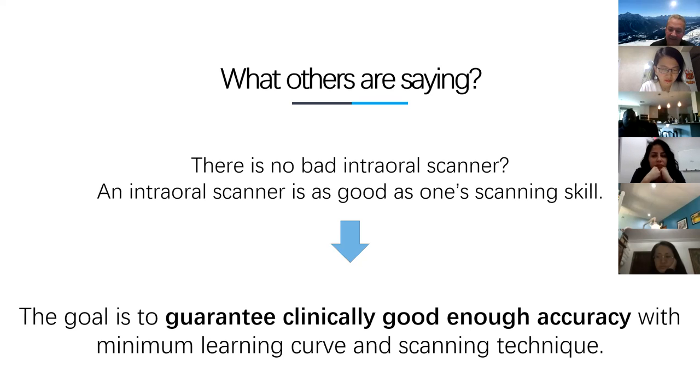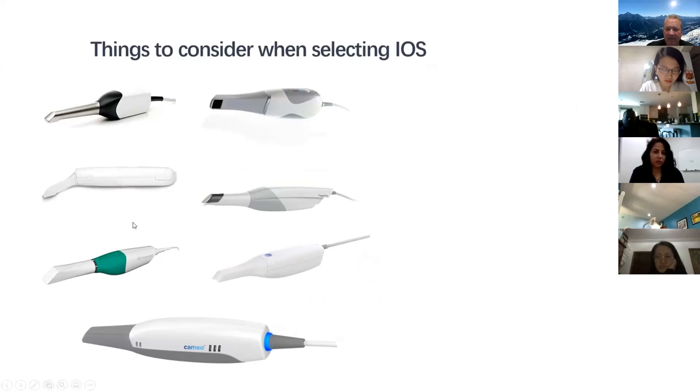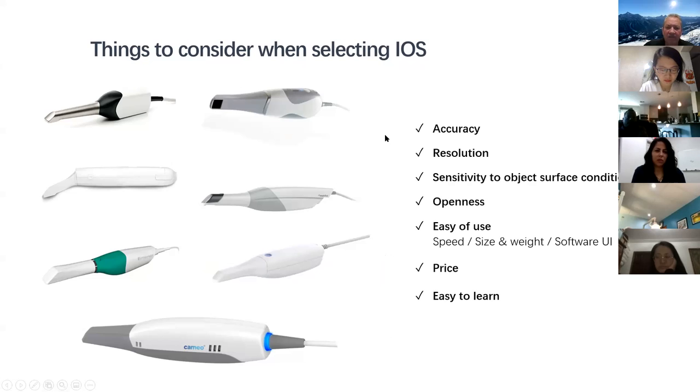That's the problem. If you look at the scanners on the market, things to consider when selecting an intraoral scanner: there are so many different scanners. They all somehow look similar. They have a head up front and then a processing part back here. But something very important is that all of them, I think, are good in accuracy. Resolution, they all are good. Now you can start saying we can take more megapixels, more megapixels. It's like with phones: the more megapixels you have, you can make a bigger picture, but your picture doesn't get better with many more megapixels. It only gets better if you want to make a big poster. So resolution, like people say, all of them are good.